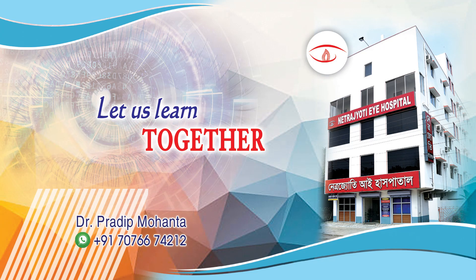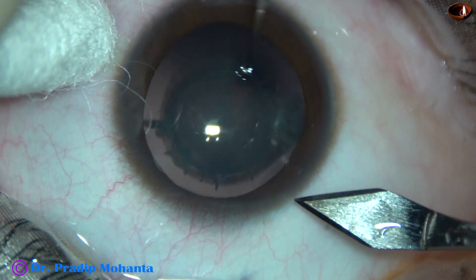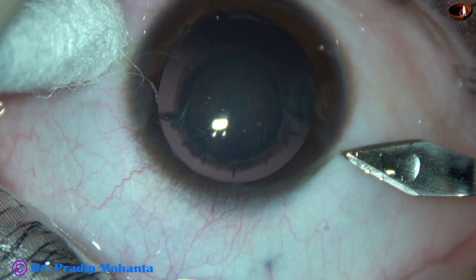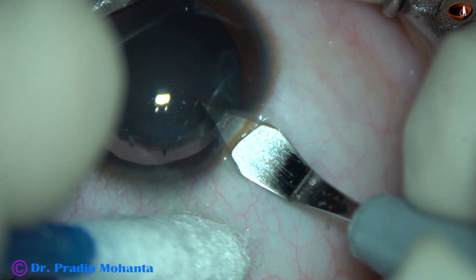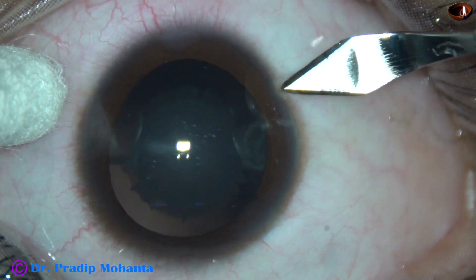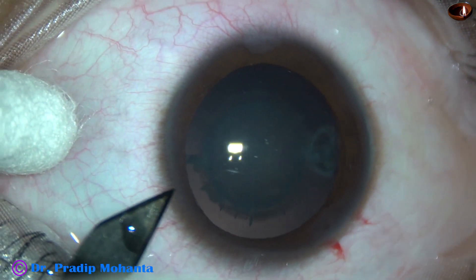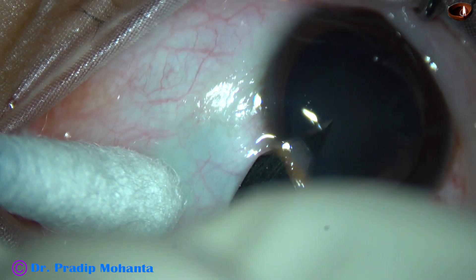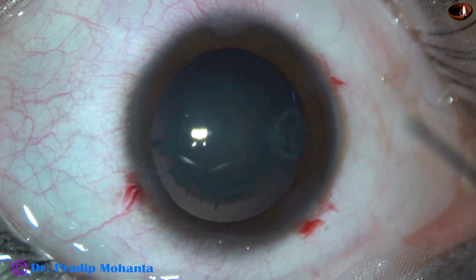Let us see how a pediatric cataract may be managed. This is the right eye of an eight-year-old boy with a lenticular cataract. The main incision is just behind the limbus and there is a rim of conjunctiva. I am making these side ports with the keratome itself, because when you make the side ports with the keratome and go just behind the limbus through the sclera, the wounds are self-sealing even in pediatric cataract.